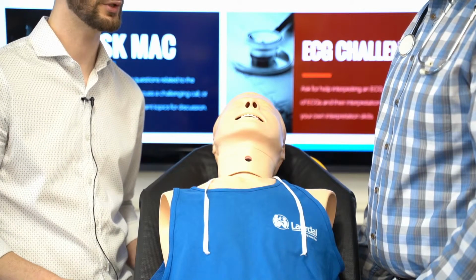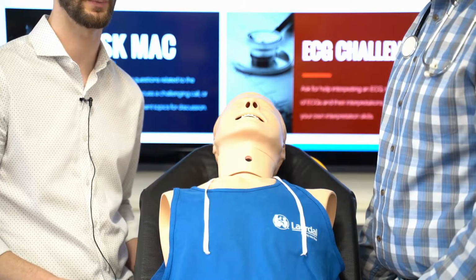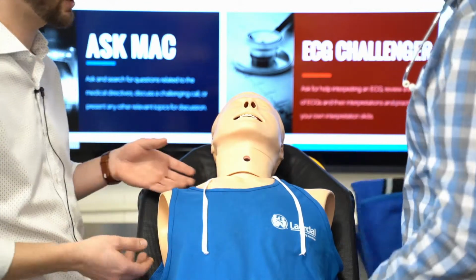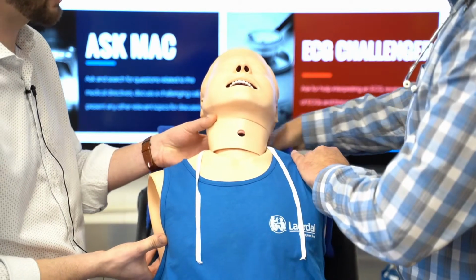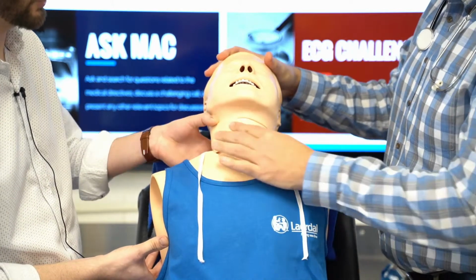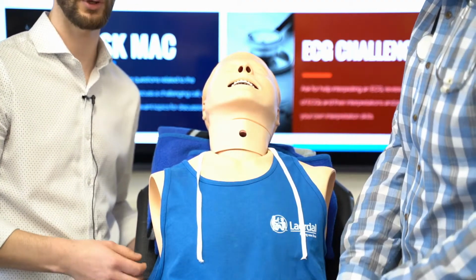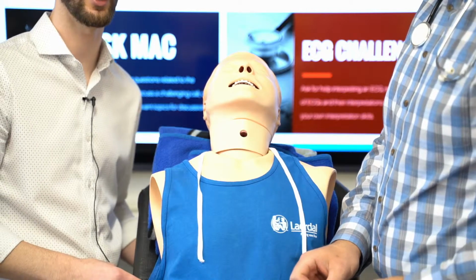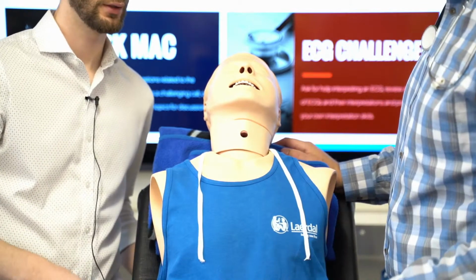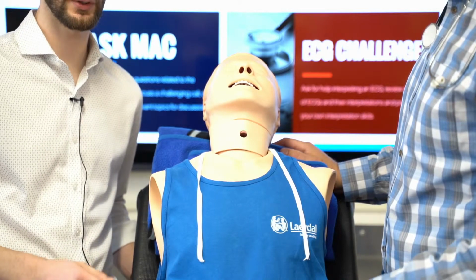Now, what we want to do is prepare ourselves for success, and that means properly positioning our patient. With this patient, we're going to have him sitting up, and we're going to hyperextend the neck, aligning all the structures and getting this patient ready for reinsertion of their airway. If not already done so, we want to pre-oxygenate our patient to the best of our ability and prepare our equipment. So now that we've prepared all of our equipment, we're okay to go ahead with reinsertion.